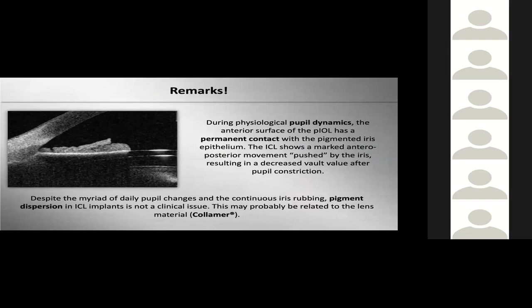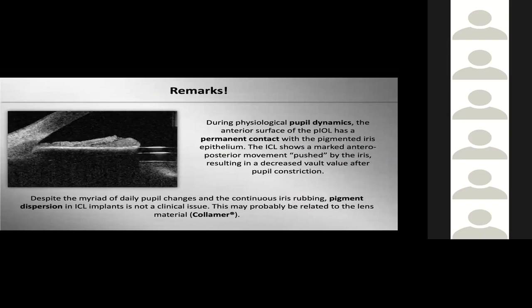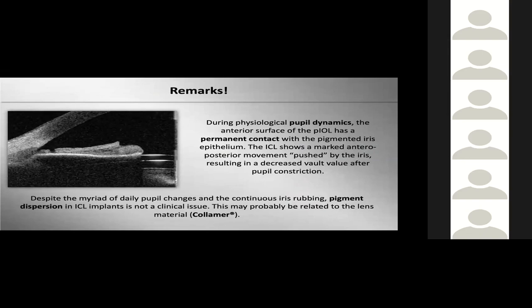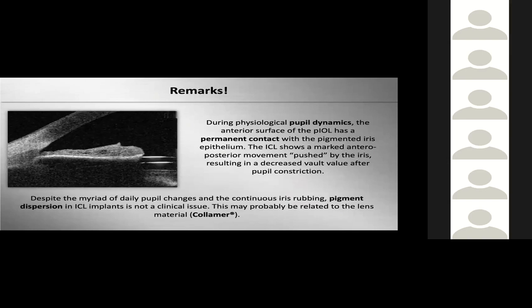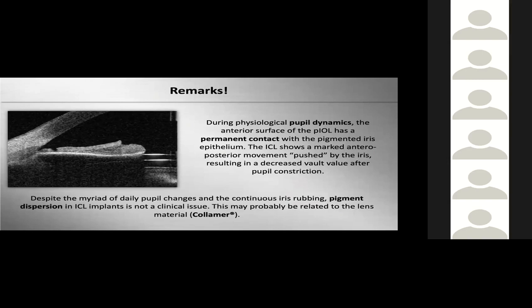I would like to emphasize that, despite the daily pupil change and the continued iris rubbing, pigment dispersion in ICL implants is not a clinical issue. This, without any doubt, is related to the material, the Collamer, of which the lenses are made.